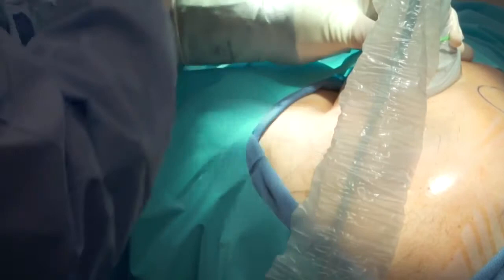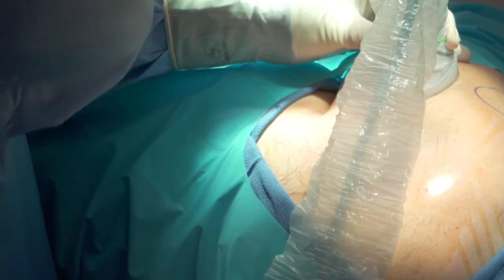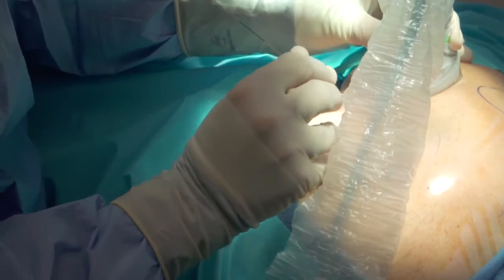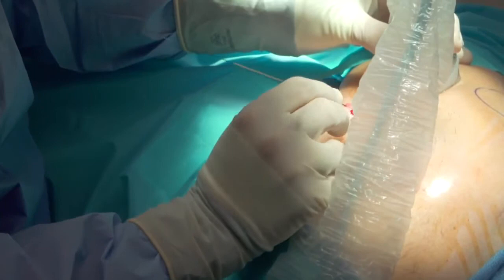All right, man, can I have the stim probe? Thank you, sir. So we're going to place the stim probe through the puncture site. John, you're going to tell me if you feel any discomfort, okay? And I'm going to try to use some more local. So you can see the probe coming across here.